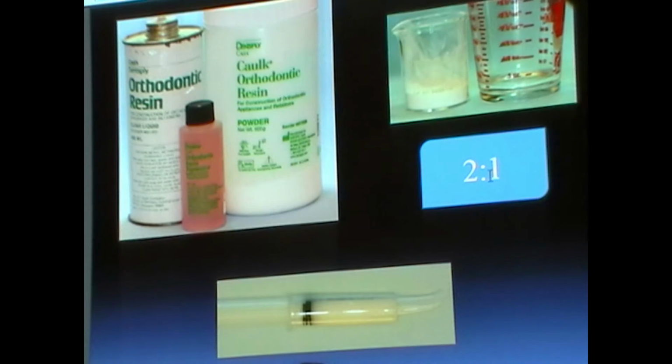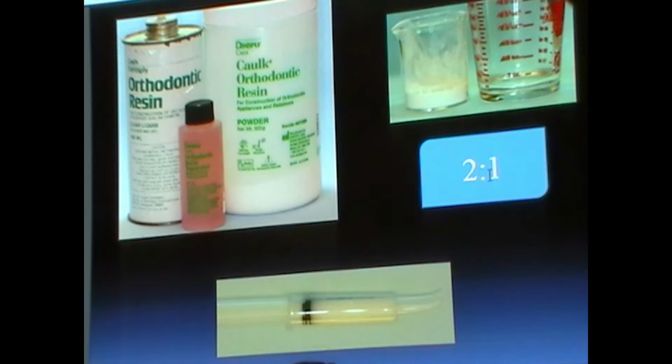The other thing is, as some of you may know, this resin, the monomer, has a very unique smell. And I'm not certain about ventilation in the simulation clinic. We will all have a contact high and be dizzy. So it is, and we have no windows to even open up. So it is best for you to try and work in groups of 2 and move quickly, okay? Because it's kind of like the glue smell, all of that fun stuff. Or nail salon, for those who know all about that, okay?